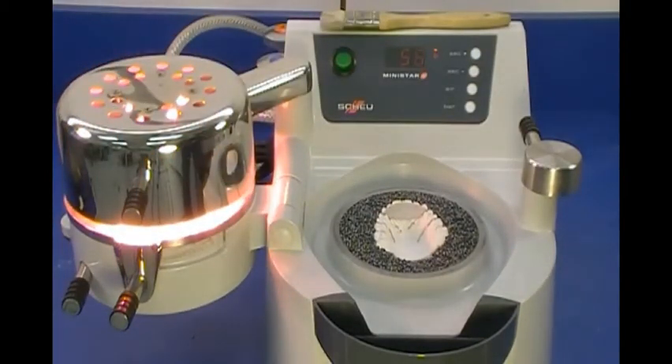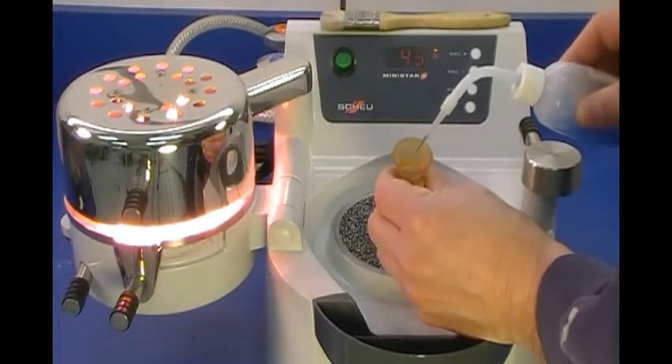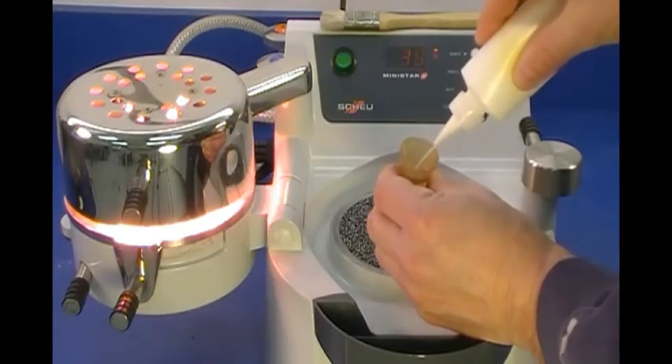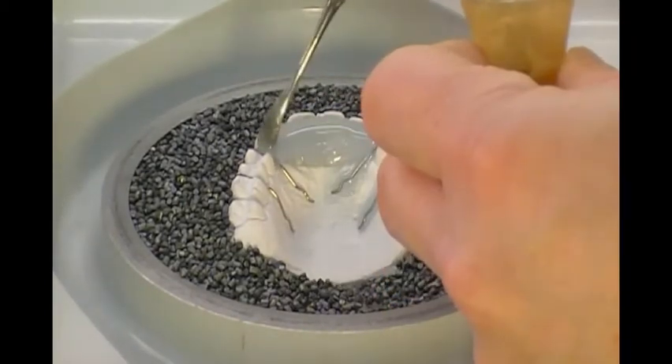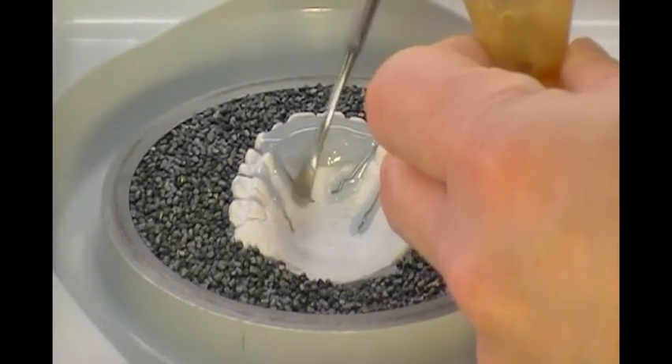With 45 seconds remaining in the heating cycle, mix monomer liquid and polymer powder to a maple syrup consistency with a number 7 spatula. With approximately 20 to 30 seconds remaining in the heating cycle, apply resin over the bite plate acrylic and retainer wires.